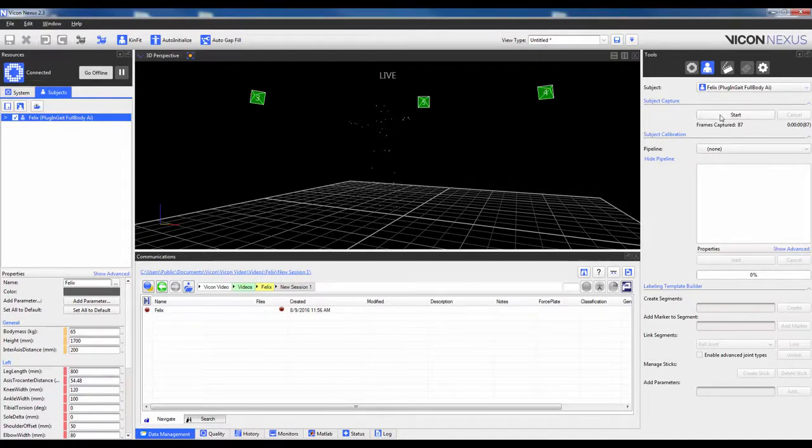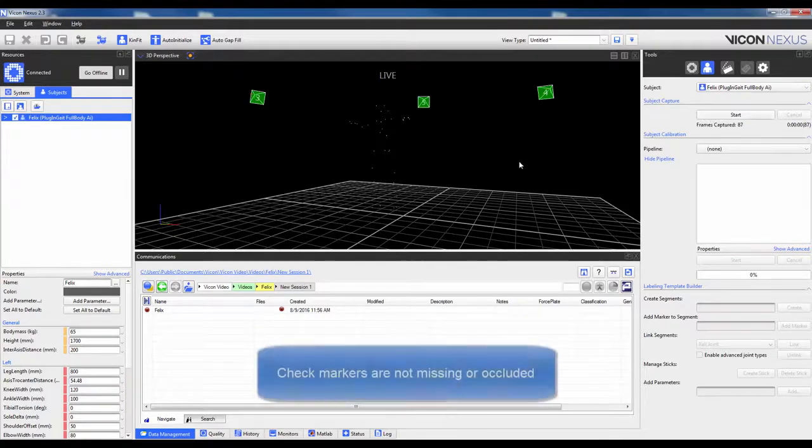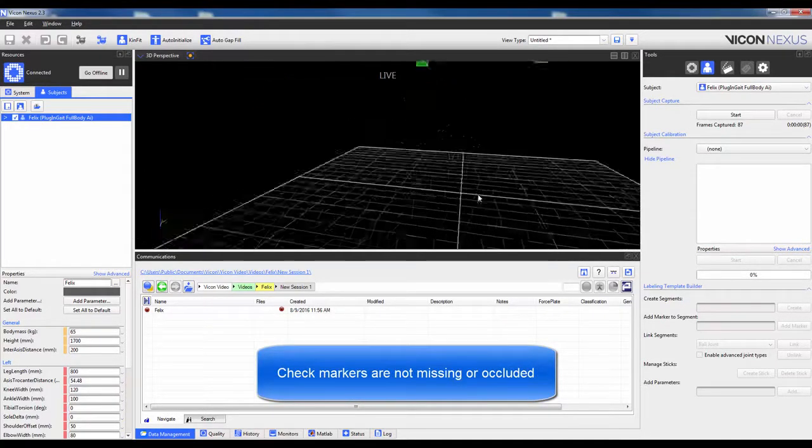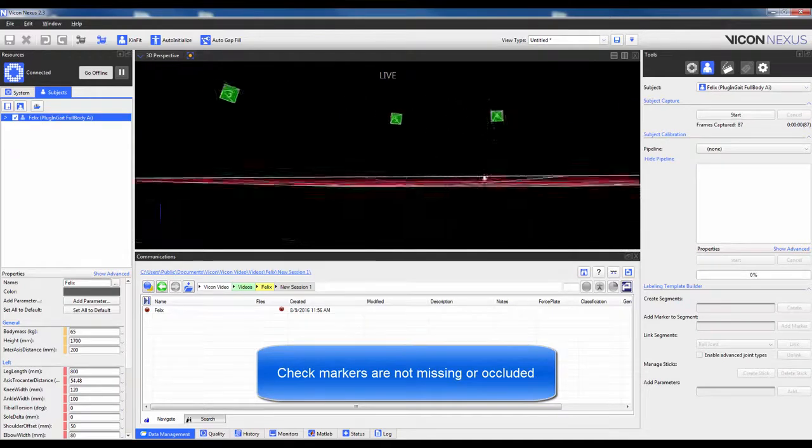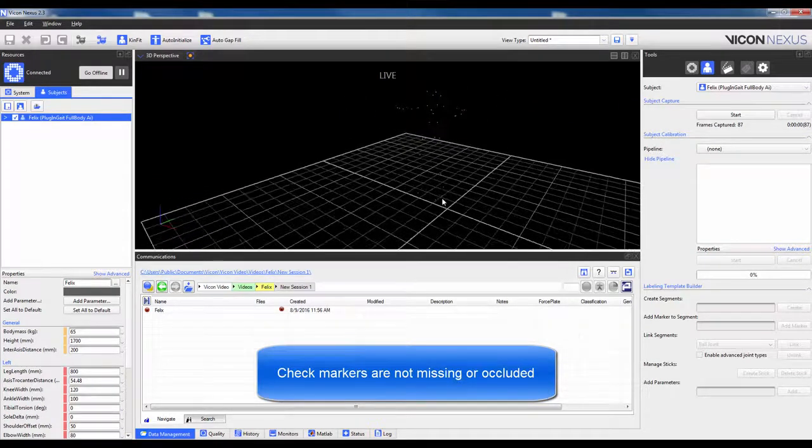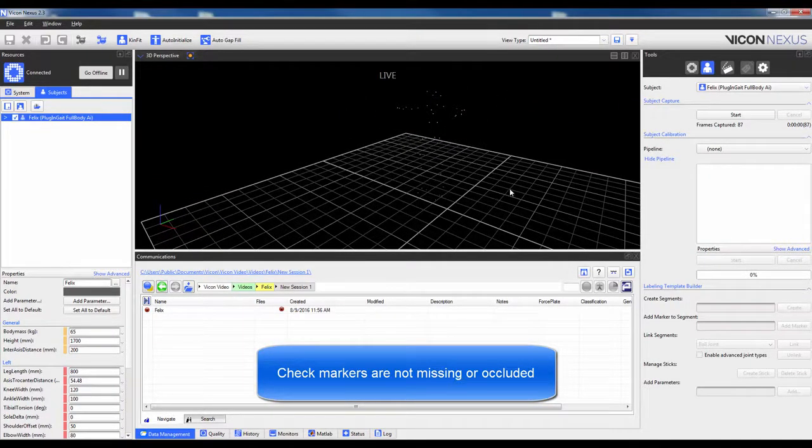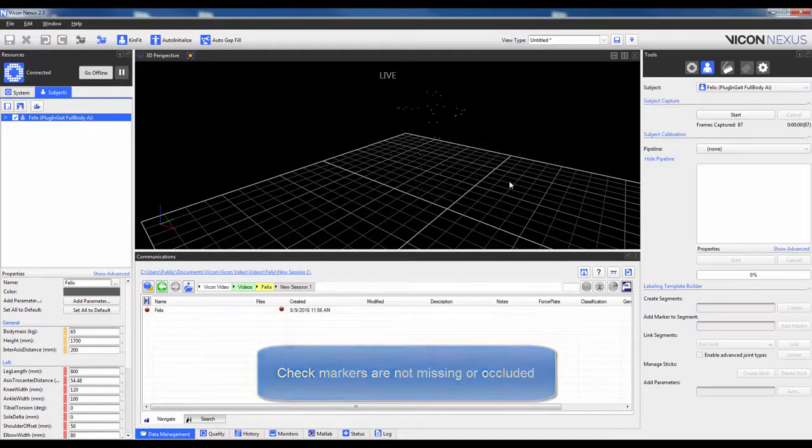Before pressing Start here under Subject Capture, try to perform a quick check to make sure all the markers are in fact visible. If they are not, make sure you have actually placed them on the subject, or that the subject is not occluding them.